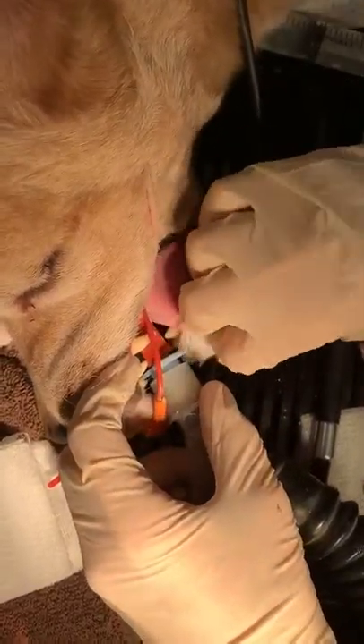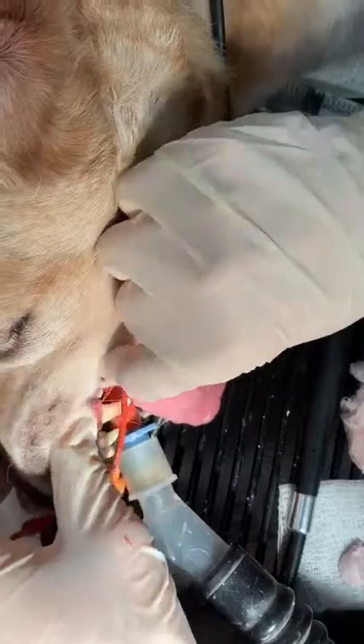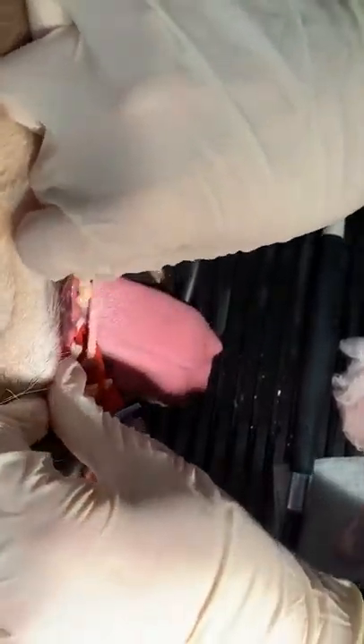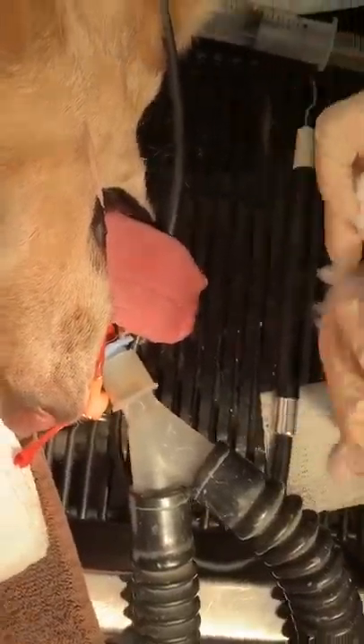Getting all this kind of stuff, getting all those chunks off. I think that looks pretty good. Ignoring that tooth, I think we're all set to go. So that is our dental cleaning — scaling and polishing. There we go.